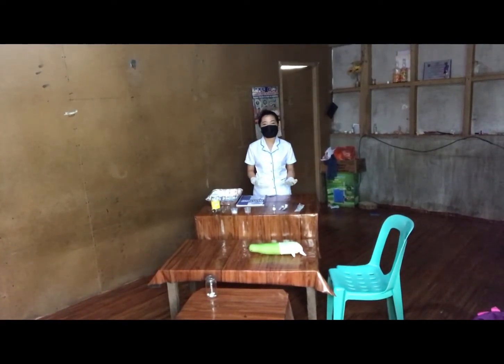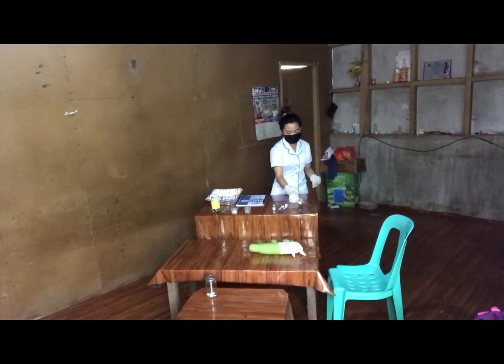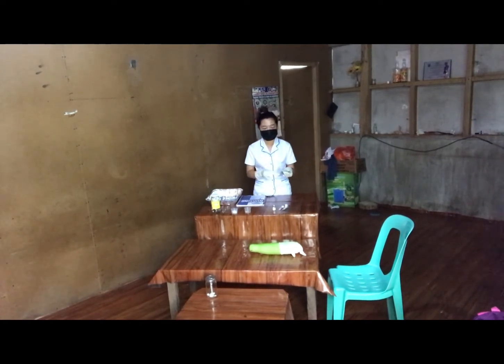So to prepare the medication for an intramuscular injection, first we need to get the 23 gauge syringe and open the sterile package. So I will open this. So it is done.